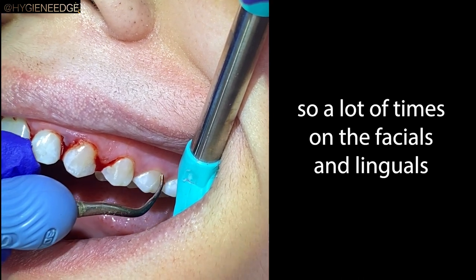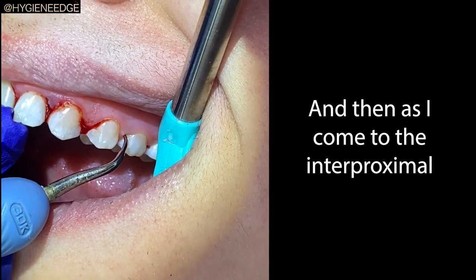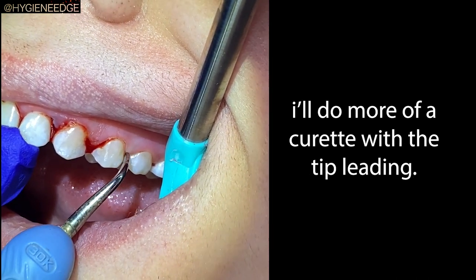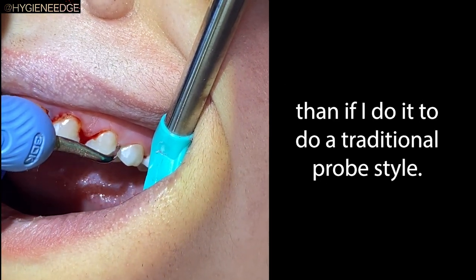A lot of times on the facials and linguals I'll do more of a probe straight down, and then as I come to the interproximals I'll do more of a curette with the tip leading. I feel like I can just get under that contact a little bit better than if I do a traditional probe.